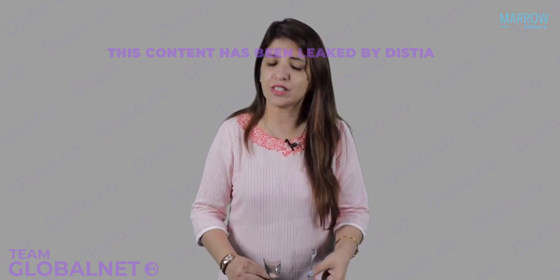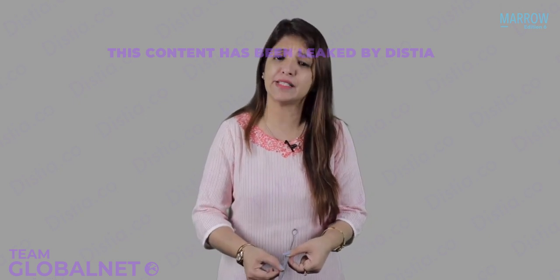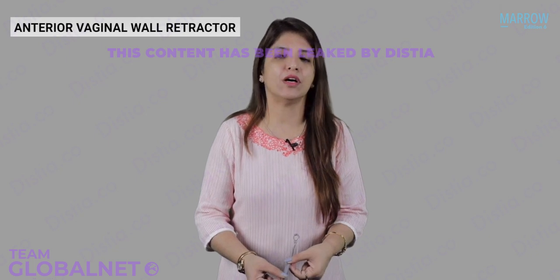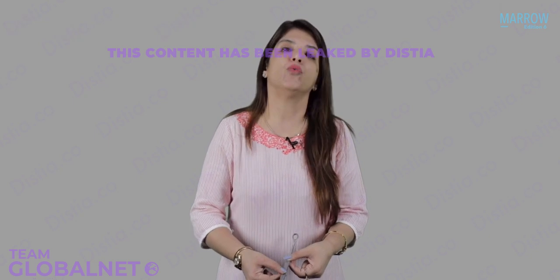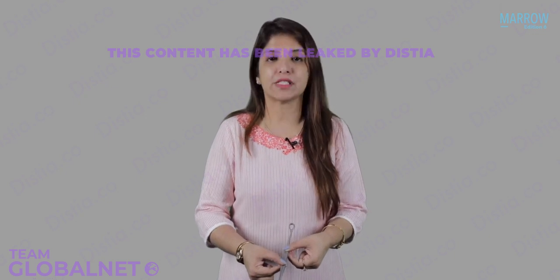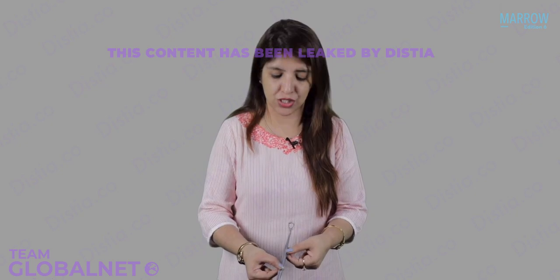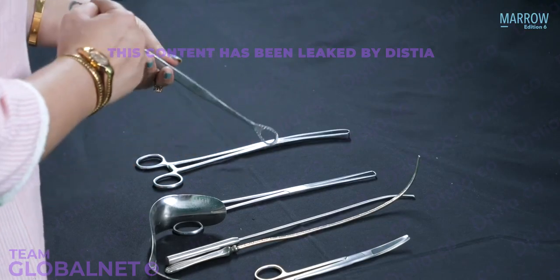To retract the anterior wall of vagina, I am going to use the anterior vaginal wall retractor. Now, there is a video which I have given on YouTube on Marrow channel, which deals with all instruments in obs and gynae. That's a very, very important video for you. Over here, I'm just telling you how you are going to identify the anterior vaginal wall retractor. As you can see over here, it has got 2 loops, right?